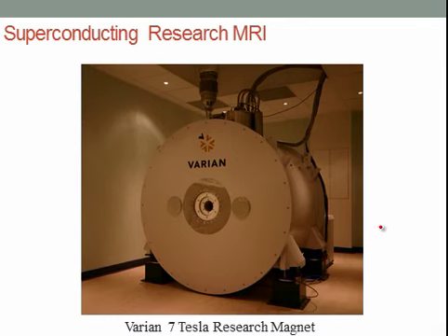Now, a lot of magnets are for research only. Although it's hard to get a feel for the size of this magnet relative to the one I just showed you, this one is physically much larger. However, you can see the bore, or the center here, is very small, because this machine is only designed to scan small animals such as mice, rats, maybe a rabbit, though it couldn't fit in there.